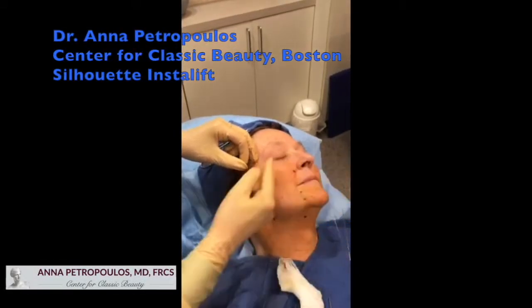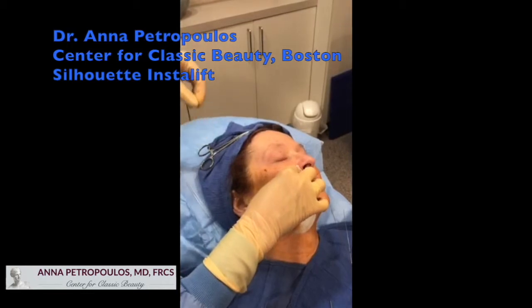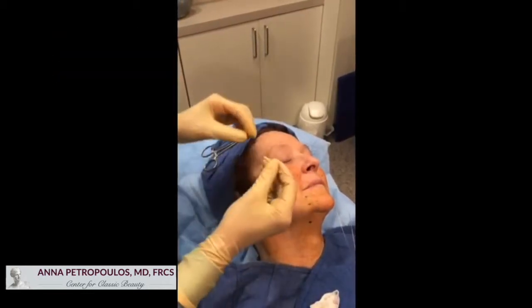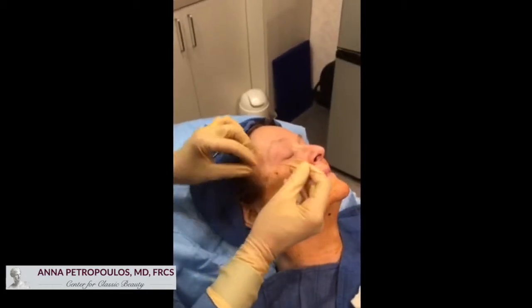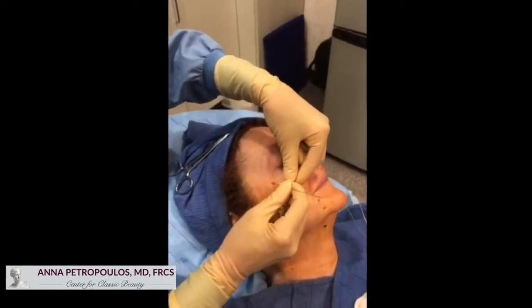We go to the halfway mark and then get the posteriorly oriented cannula. We enter it with the bevel facing posteriorly while retracting the suture to give us access to our puncture hole.